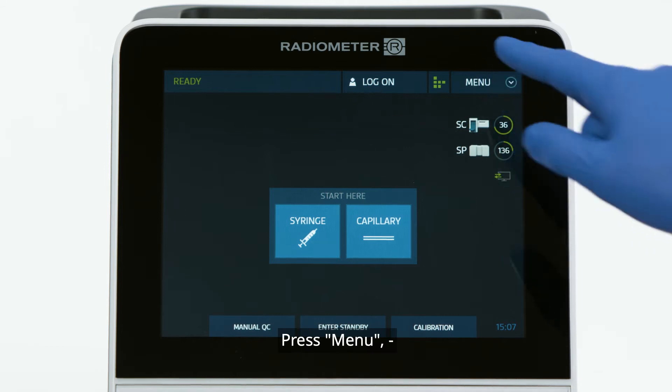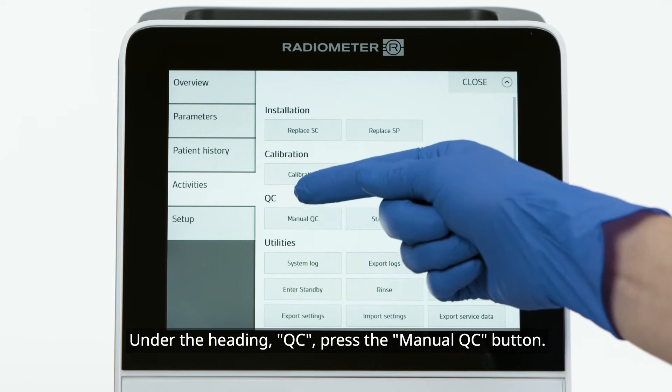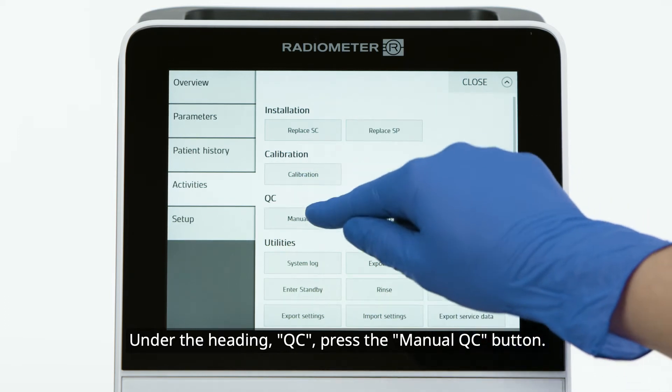Press Menu, then Activities. Under the heading Quality Control, press the Manual QC button.